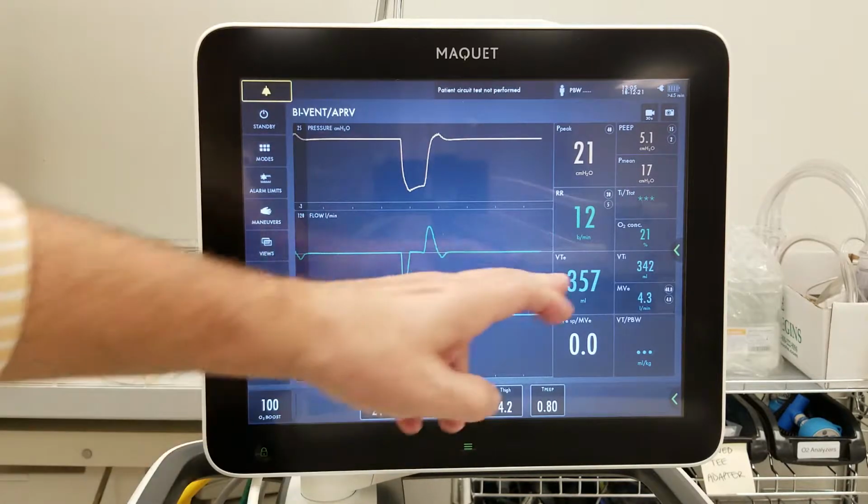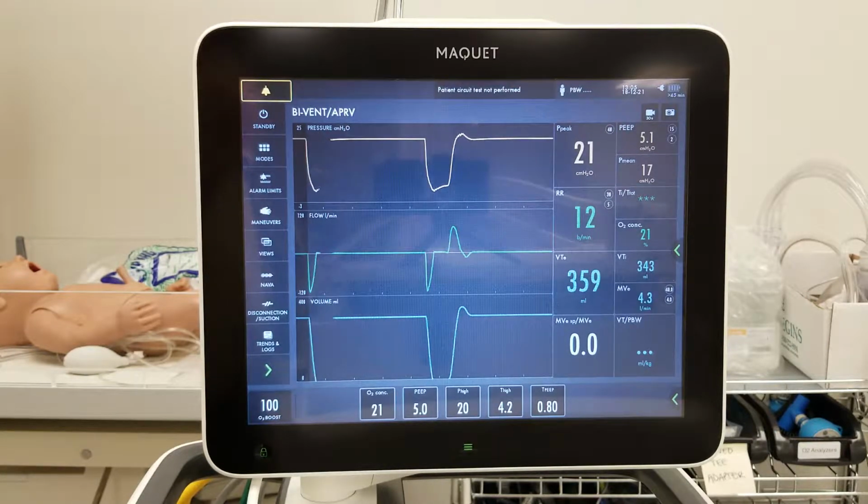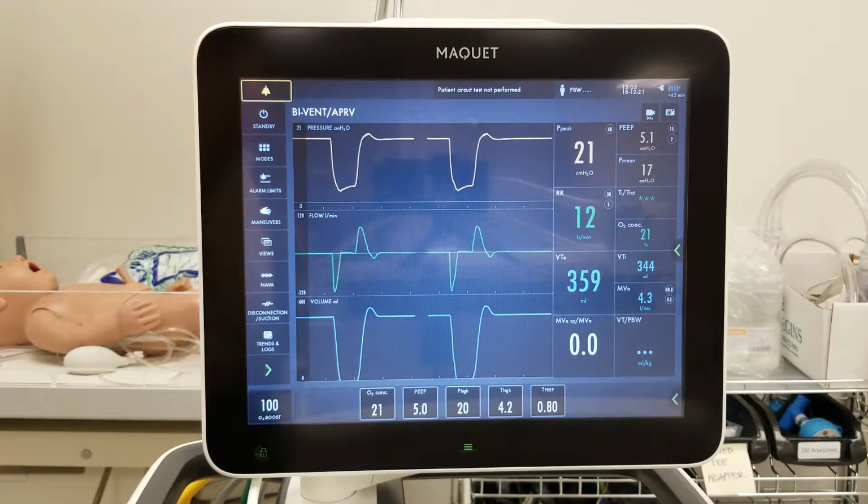That's what's occurring. So then we look, is that tidal volume adequate for our current patient with a 70 kilo ideal body weight? Remember, we set that up yesterday, 175 centimeter. He had a 70 kilogram ideal body weight. We're still in the same patient today. So is this enough? Well, we find out that this actually should be pretty close, right?